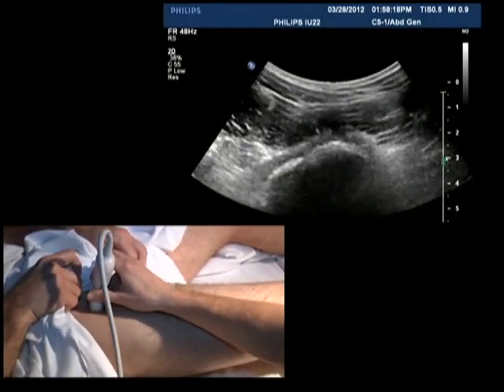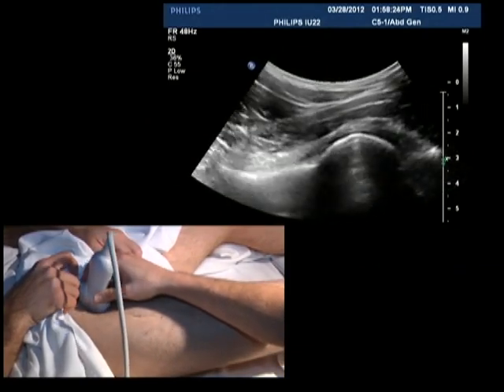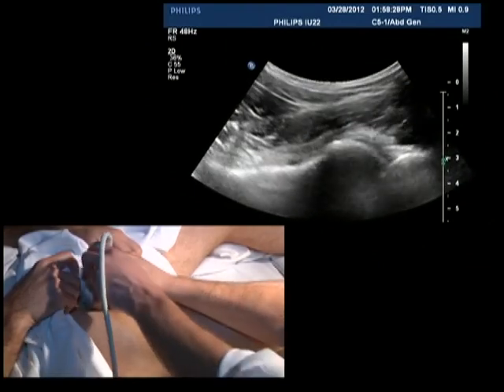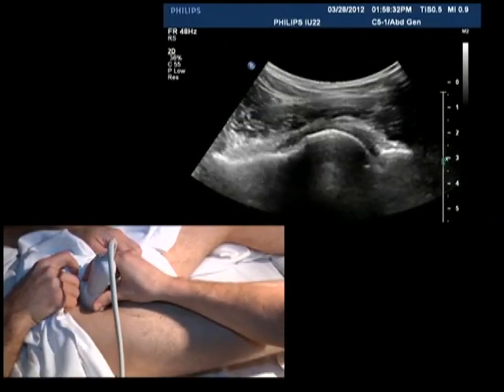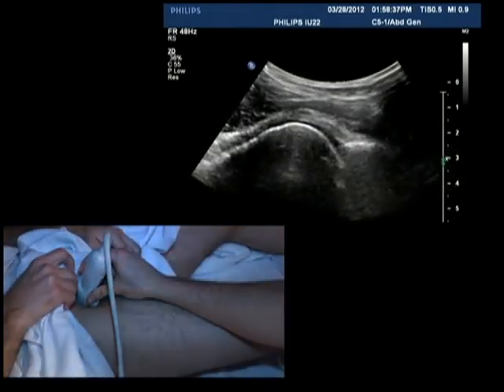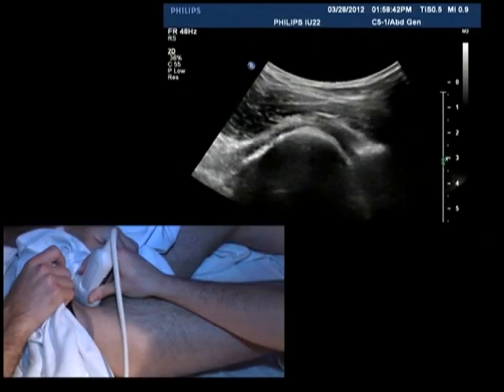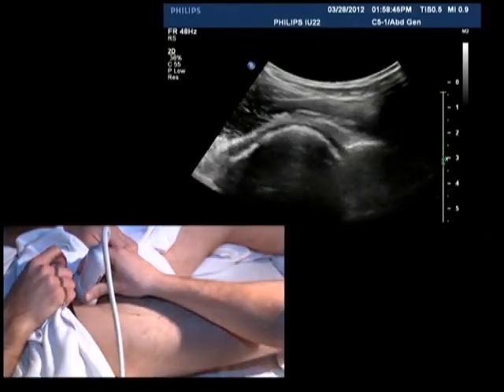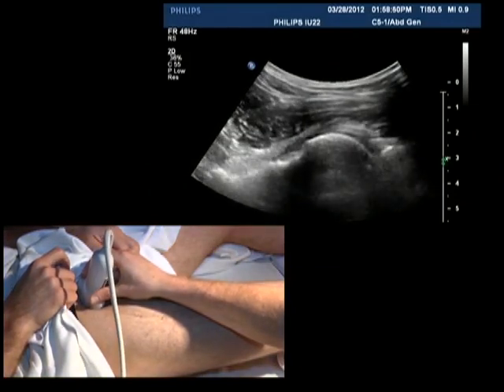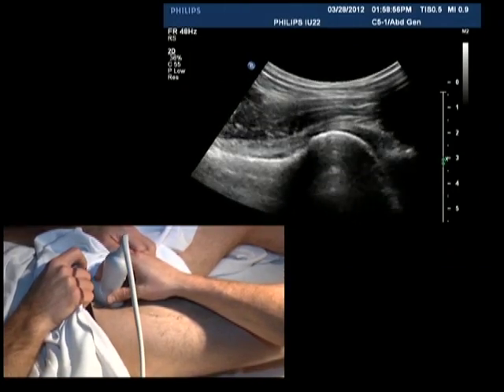You can see transversely oriented compared to the patient, structures are still a little bit confusing. You want to turn into that oblique axial plane, as we call it in the MRI, or longitudinal to the femoral head and neck, and that'll bring all the structures appropriately into view. So here you can see the acetabulum superiorly. I'm pressing somewhat hard on the patient here to bring all those structures into view, but you can see the echogenic margin of the acetabulum, as well as the femoral head. Thin line of hyaline cartilage, not very well demonstrated with the low frequency transducer. We'll show that a little bit better with the 12 megahertz here in a moment.